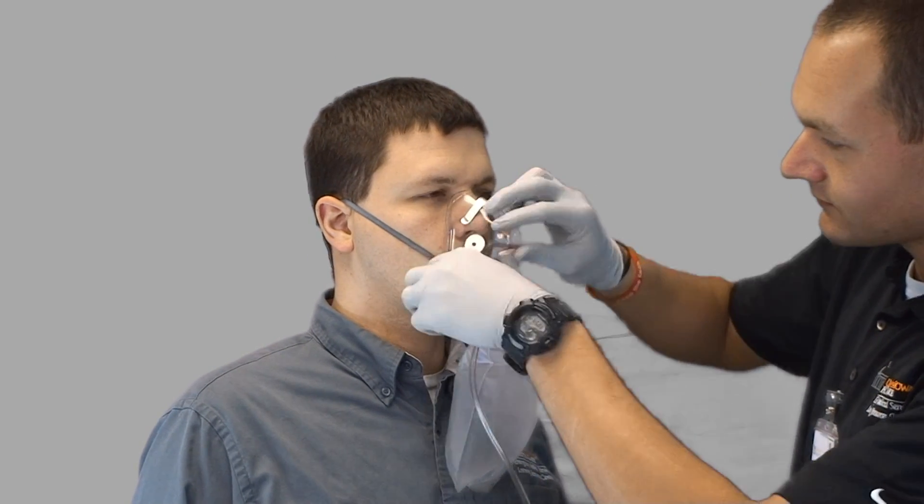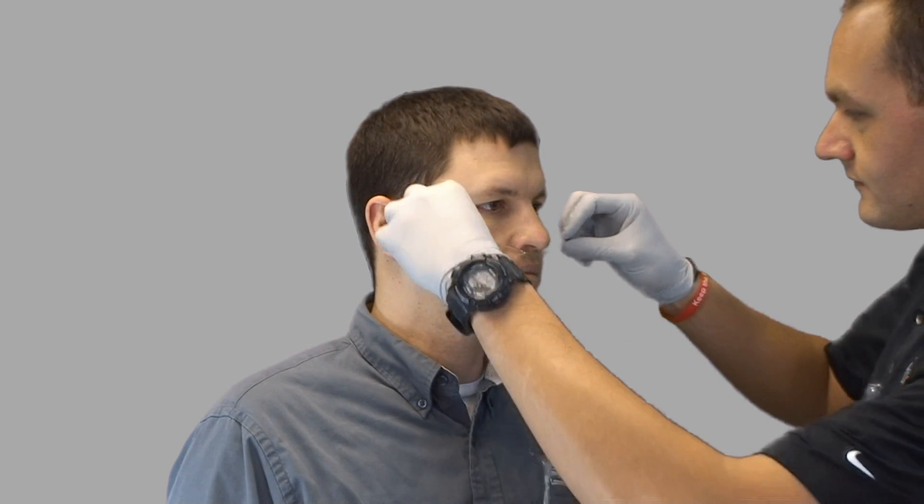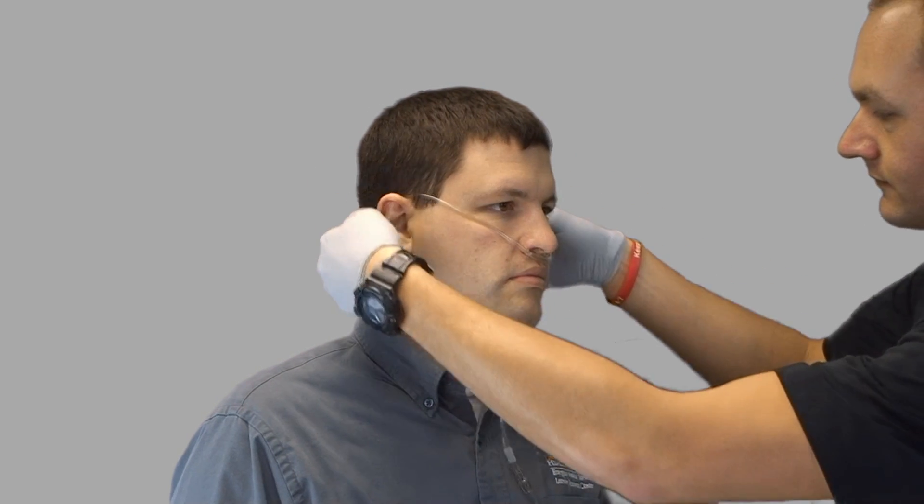If the patient does not tolerate the mask, I may be able to switch to a nasal cannula. After removing the non-rebreather and turning off the flow of oxygen, I detach the oxygen tubing and connect the nasal cannula. I will adjust the regulator to flow 1 to 6 liters per minute of oxygen and place the nasal cannula on the patient's face by placing the prongs in the patient's nose, securing the tubing around the patient's ears, and cinching the tubing under the chin.